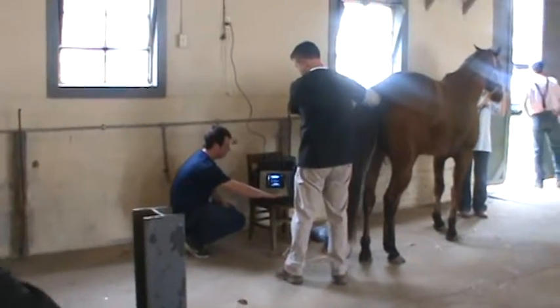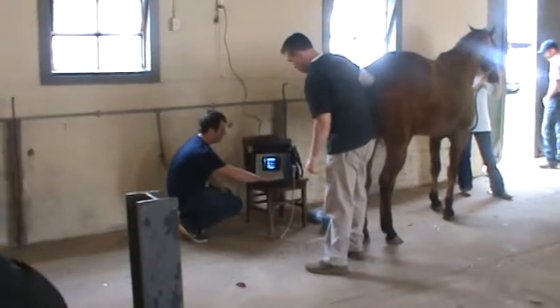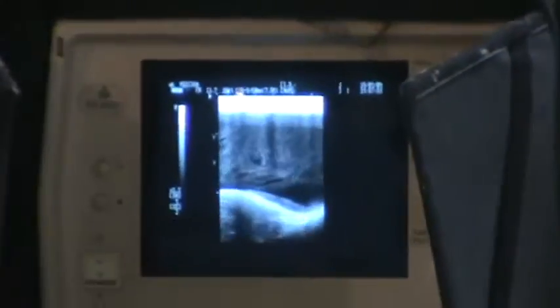We're just going to go in, and you really probably are too far away, but one of the first things that I notice here is that this mare's bladder is really, really full. All of this swirly structure that looks kind of like, I don't know, cheesecake? Turtle cheesecake? Sorry. That is bladder that is full of urine. And you probably don't remember because you haven't been to vet school yet, but the horse's urine is really, really foamy. When a horse urinates, if you've ever watched a horse, there's a lot of foam. Well, that's what you're seeing there on that ultrasound machine.